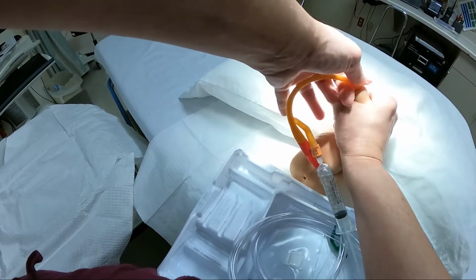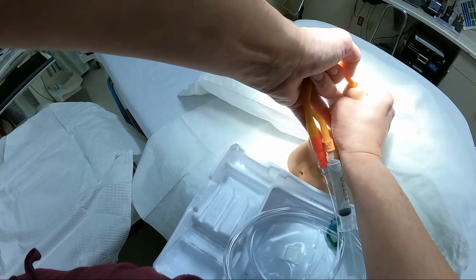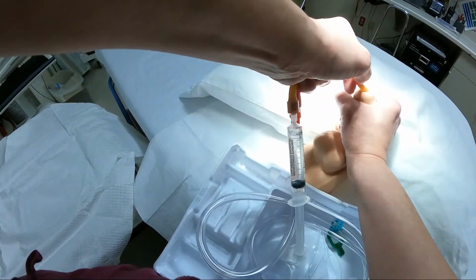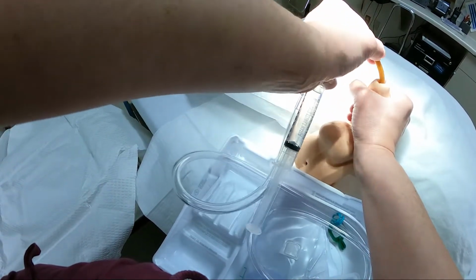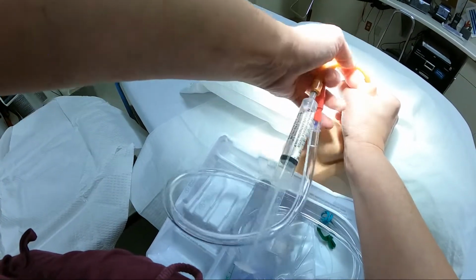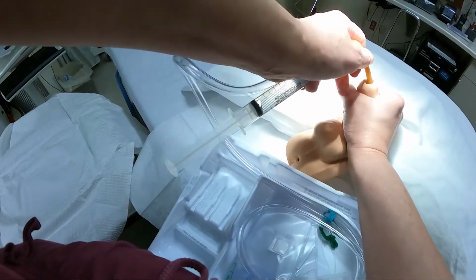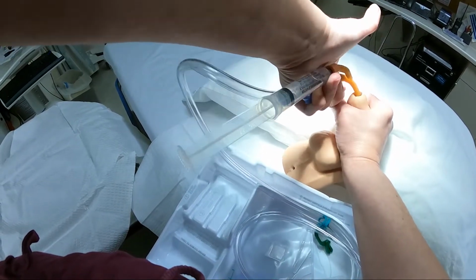Now, once you get to the bifurcation, pretty sure we're okay in this dude, but some guys you do have to go all the way to the bifurcation, which with this little guy may be a little difficult. Sometimes you do have to go little by little. Take deep breaths, relax. It's okay, Mr. Dude. It'll be over shortly.